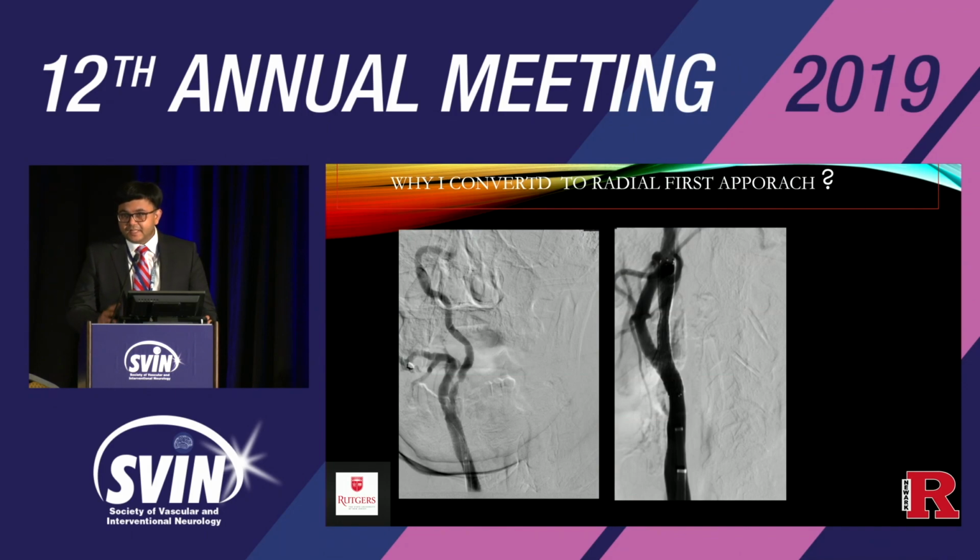So 30 minutes later, the patient started to drop his pressure. It went from 100 to 80 to 60/0. He's tachypneic. He's unstable. The first thing for young trainees, after a procedure, when this happens, you have to think about retroperitoneal hematoma, or there is bleeding somewhere. The patient is on dual antiplatelet. We anticoagulated this patient with full dose heparin. So we brought this patient straight to angio, no CT scan.